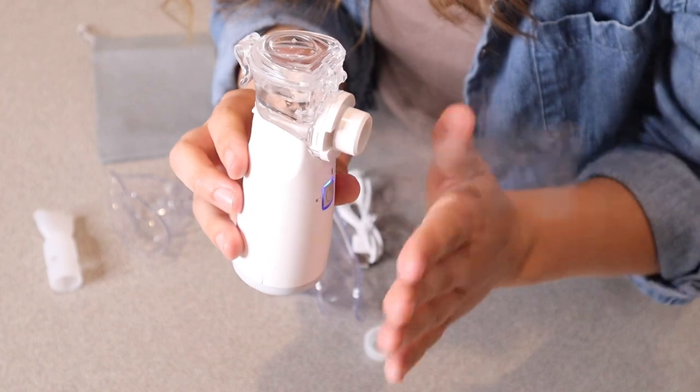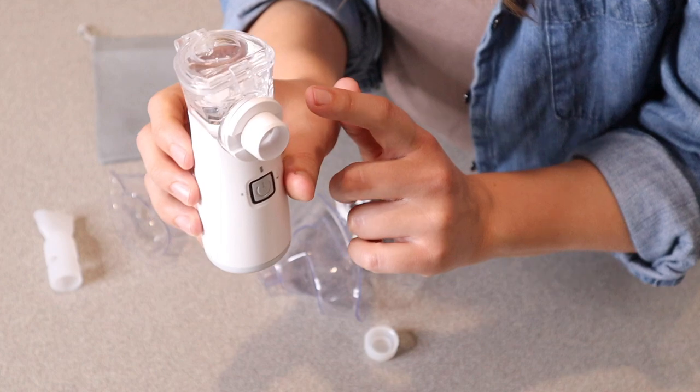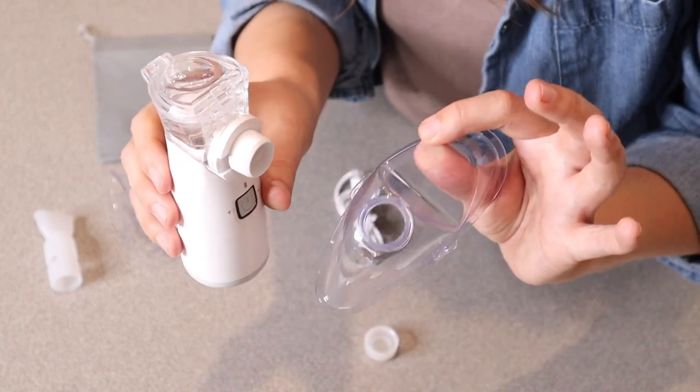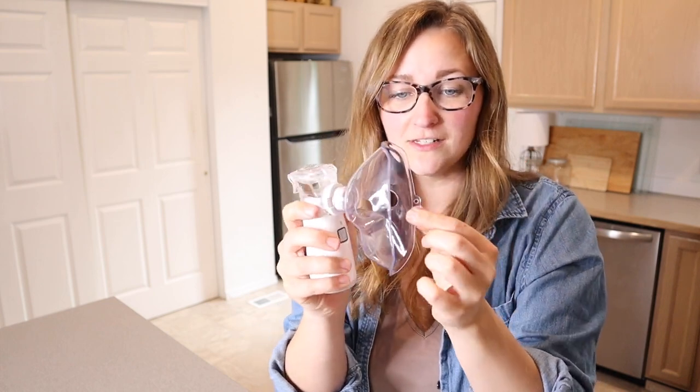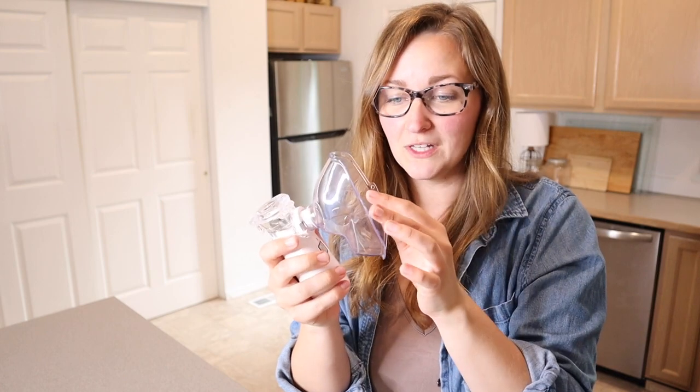You can definitely see that it's really nice and quiet and it's a nice constant stream. I'm going to go ahead and put the adult mask on so I can show you what that looks like. You can see I just pressed the adult mask right into place and it does have an option for putting some straps on here if you would like to use them.